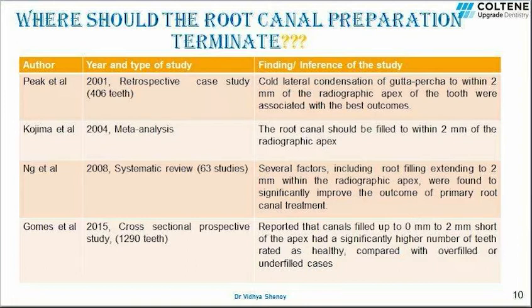This is at a distance of 0.5 mm from the apical foramen in younger patients and at a distance of 0.8 mm in case of the older age group. Why the apical constriction? Because at this point the wound site will be small and it can cause optimal healing. And beyond this point, there is a chance that the instruments and the obturating material can encroach the periapical region.